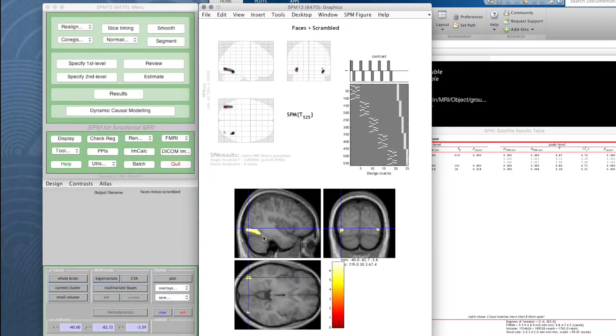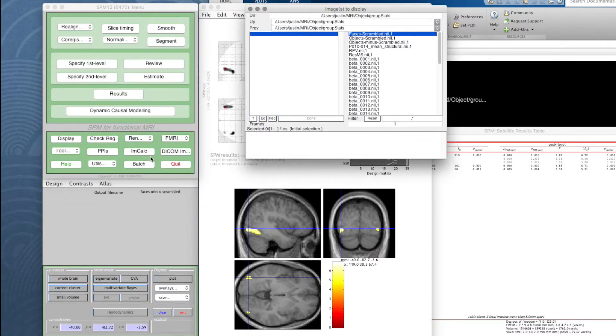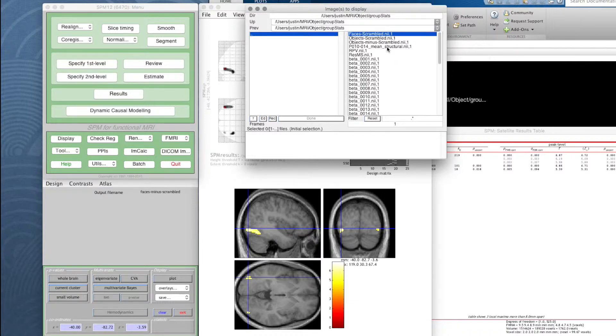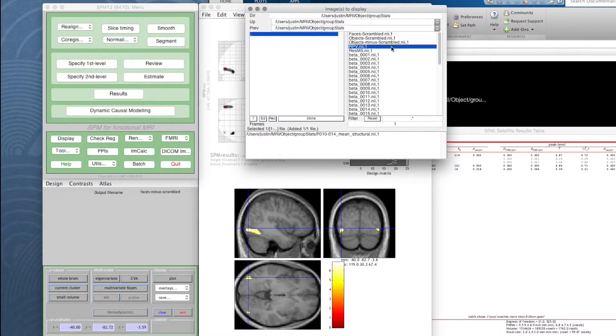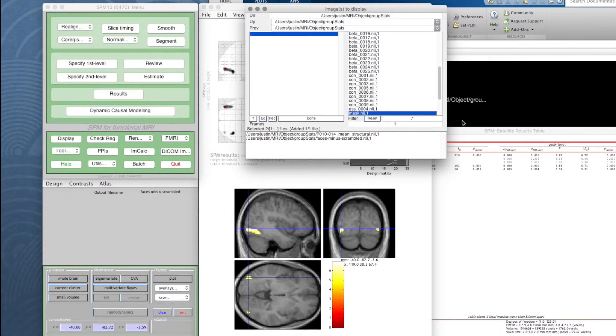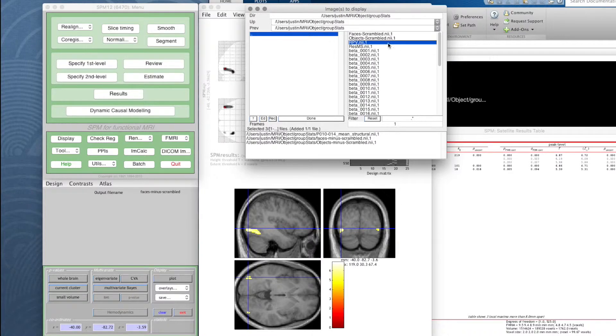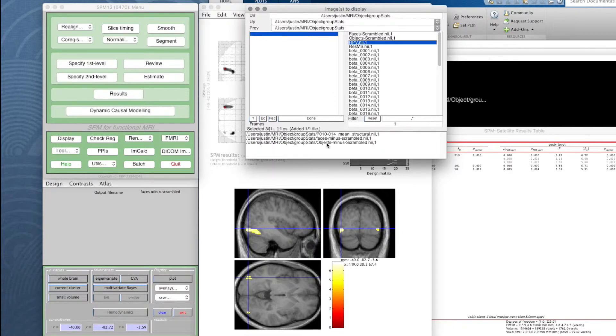So if we go to render and slice overlay, it says images to display. We're going to select one of the images, this mean structural, but we're also going to select objects, no faces, faces minus scrambled and objects minus scrambled. So I've selected three images, one is a structural image and these two are these thresholded SPMs or blob sets that we've saved as well. So I now click done.